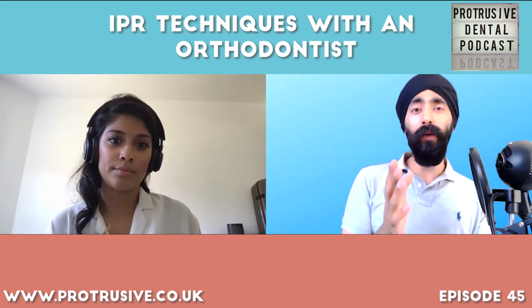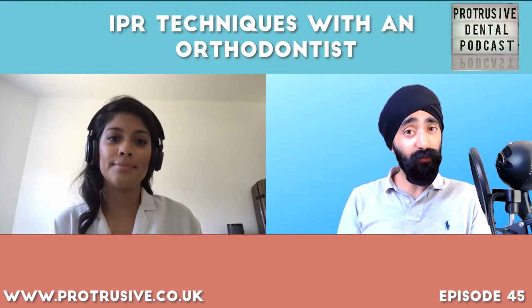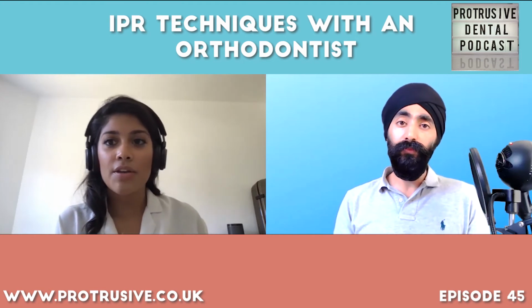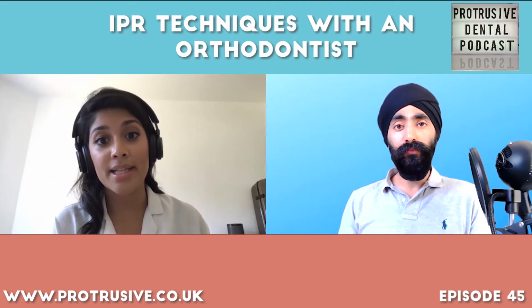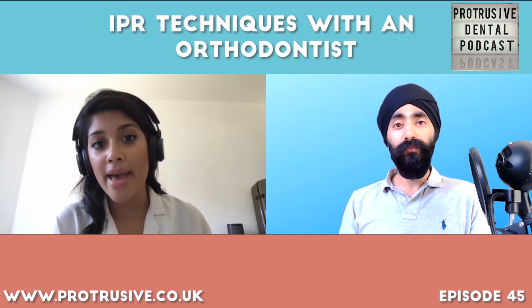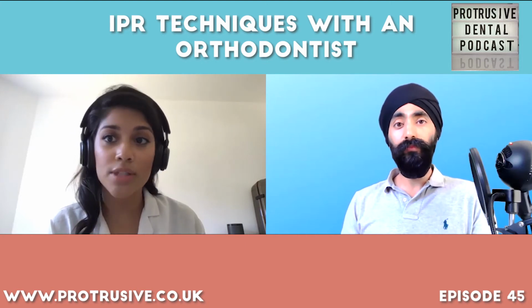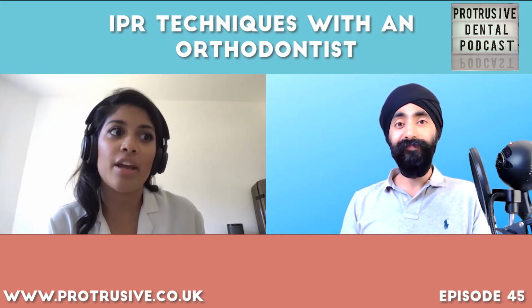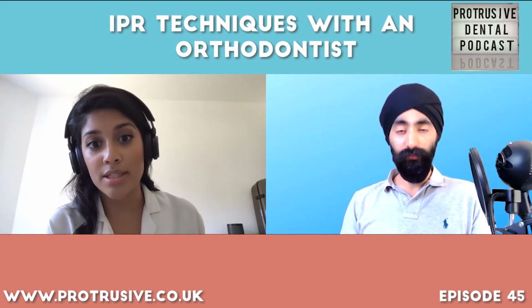I think there was one about how IPR can actually improve your stability. Do you want to just touch on that? Yeah. So there has been research to show that IPR can even help stability post-treatment. Peck and Peck suggested that if you have parallel edges, then there's less chance of contact slippage. So in theory, your teeth should remain stable after treatment.